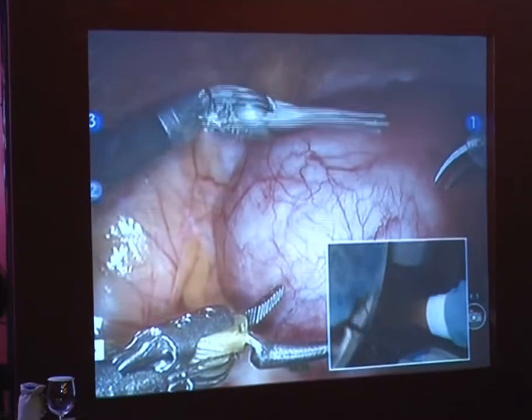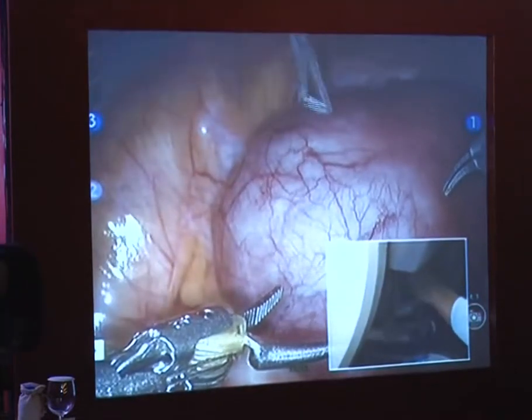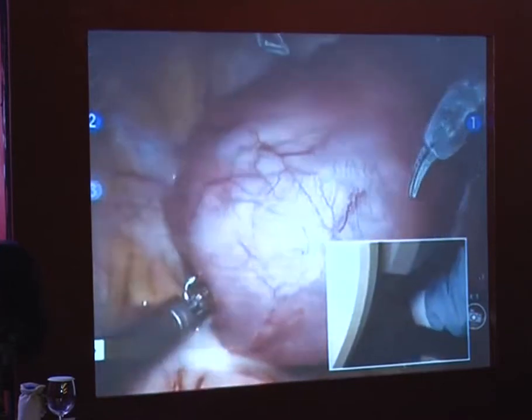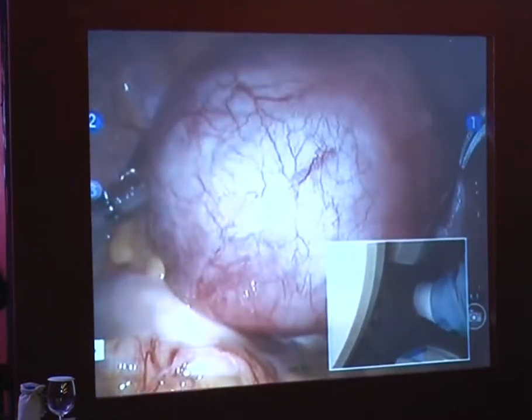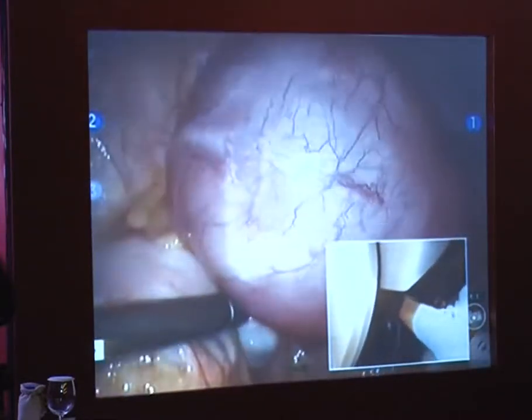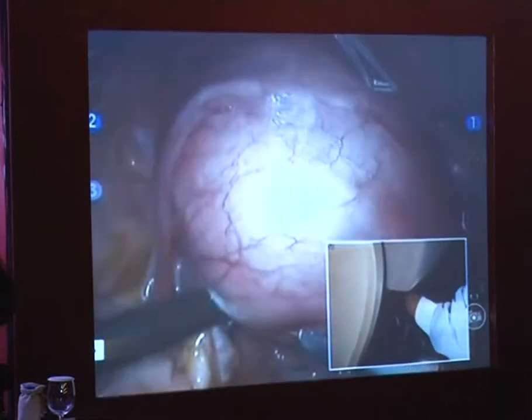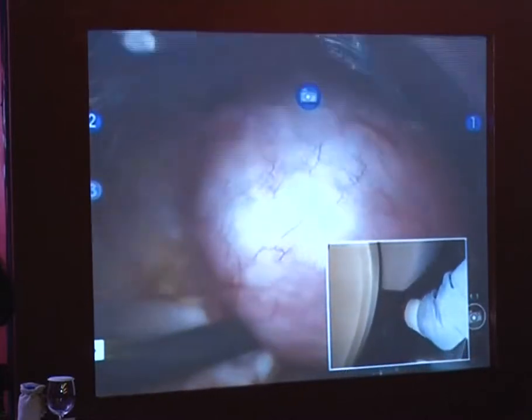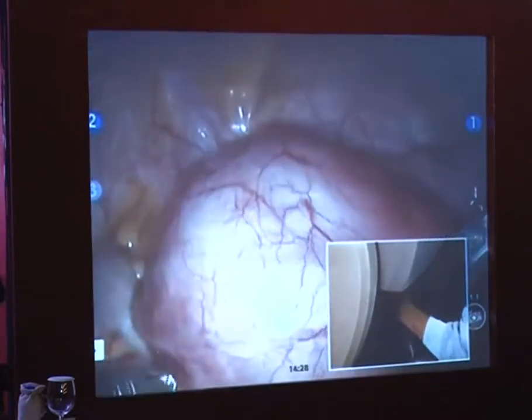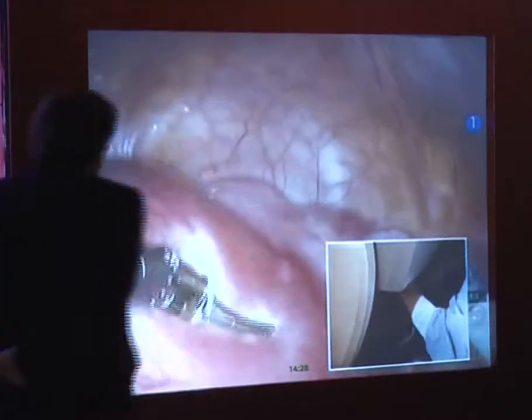She's got a couple other little fibroids in here. The fibroid here we can deal with in the broad ligament there. Now the thing is, we have to decide what's the best direction to make this incision, whether we choose to do a vertical or a modified horizontal incision. The reason being that even with the robot, it is difficult to sew with a vertical incision, because you can see already that I've maxed out the rotation of the endo wrist. So it's going to be preferable for me to figure out a way to do this without necessarily making a vertical incision if I can avoid it.